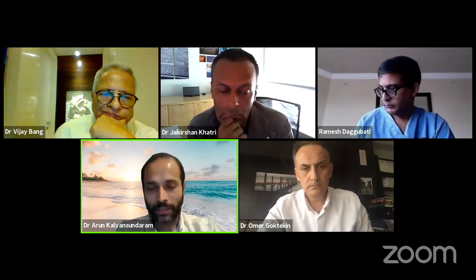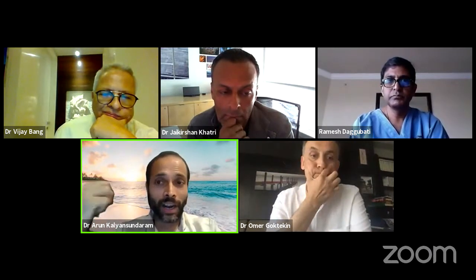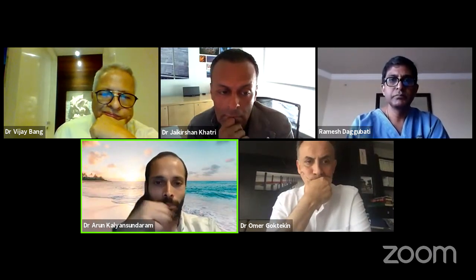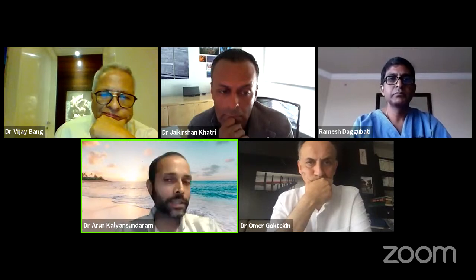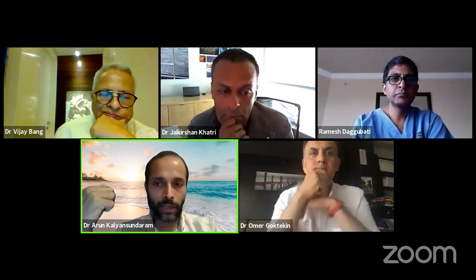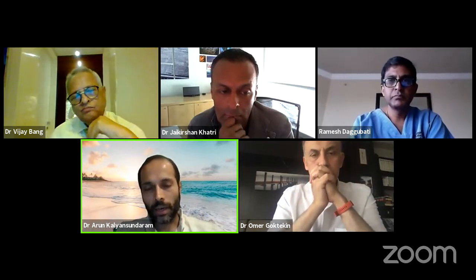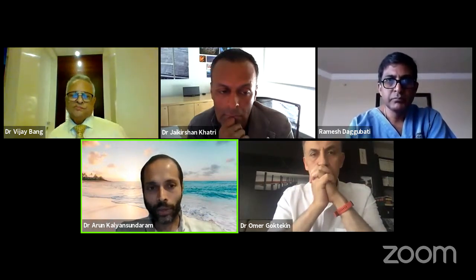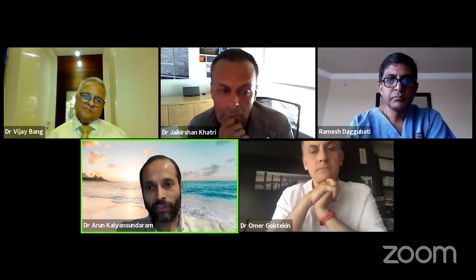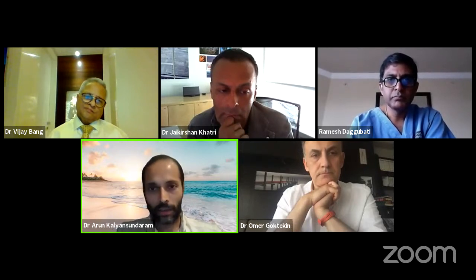So again, it depends. In India, one factor that we always think about is the cost of the procedure. So the Stingray balloon comes at a different cost. So if I have a reasonable retrograde option, I'm going to take it, if I think my chance of ADR is not that high. But typically when money is no object, I'm already there. So the worst I can do is fail. And if I fail in ADR, I'm already set up for reverse CART. So to me, it's not a big deal if the patient can afford it.